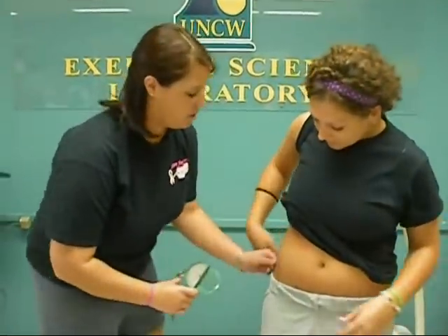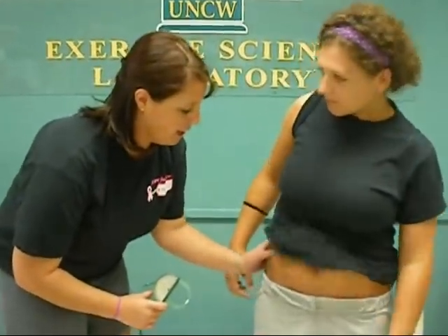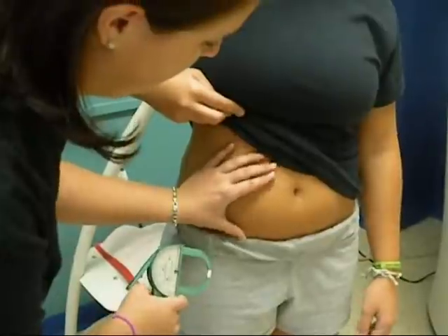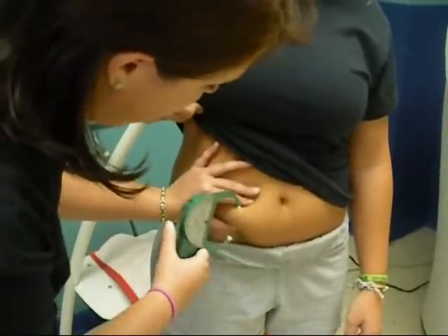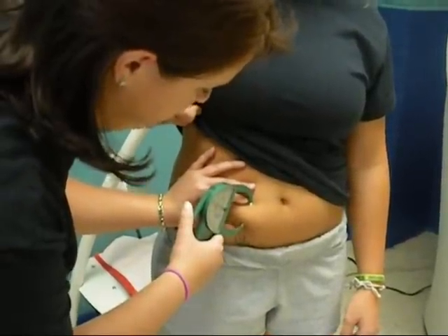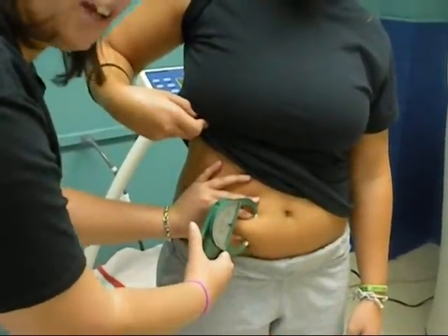Then we're going to move to the iliac. You're going to go from the iliac, which is the top of your hip bone, and move towards your abdomen. Pinch it together there, find the fat, and take a measurement. Make sure you don't just pull it off.